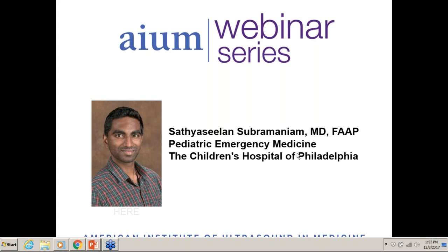I've seen Adam Sivitz. He and I scanned once, and I learned a lot from him. He showed me a method where you could use the linear transducer and slide it. Basically, instead of having your probe anterior to the right lower quadrant, you're sliding your probe to a lateral position, and your beam is pointing right into the psoas muscle area. It's a lateral posterior approach, and that's one way of getting the retrocecal appendix.